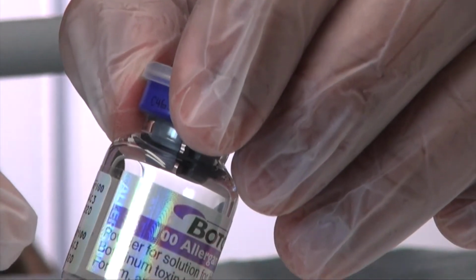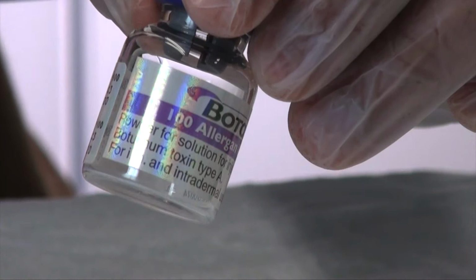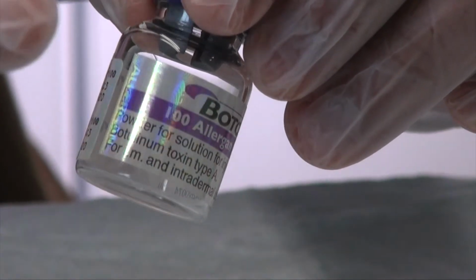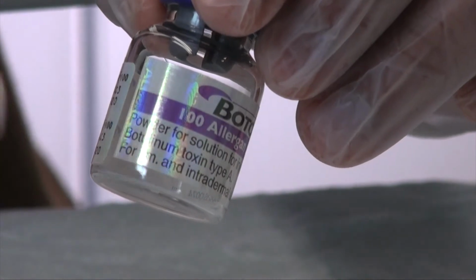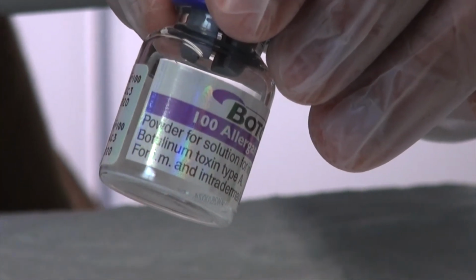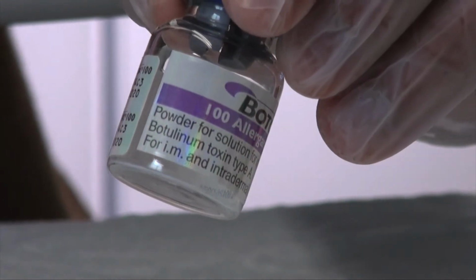The excipients of Botox are sodium chloride and human albumin. This is worth considering if you are going to be injecting someone who has issues with human blood products. So now we are going to reconstitute Allergan Botox 100-unit vial.